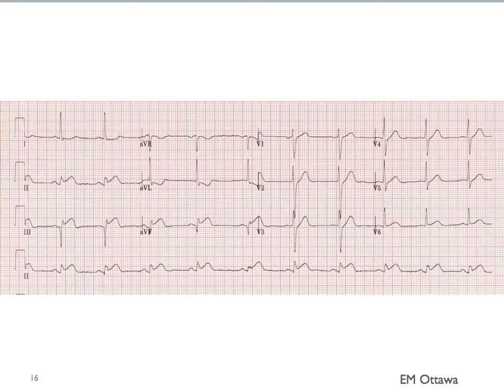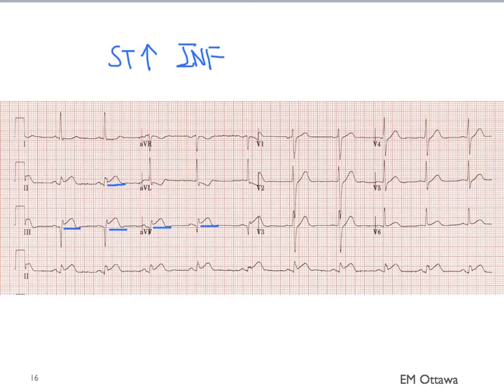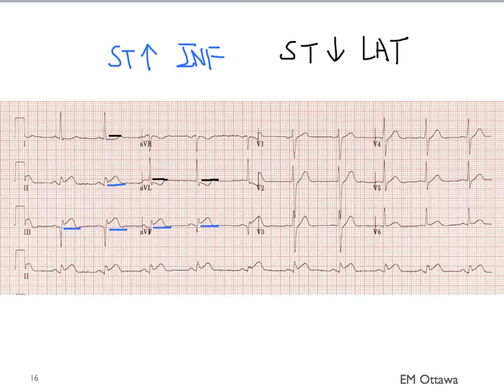Let's go through some examples. I want you to pick out the ST elevation and the ST depression. Where are the ST elevations? They are in the inferior leads — they belong to the same territory. Do you see the ST depressions? They are in leads 1 and AVL — the depression in lead 1 is very subtle. That corresponds to the lateral leads. Therefore, this is an acute inferior ST elevation MI.